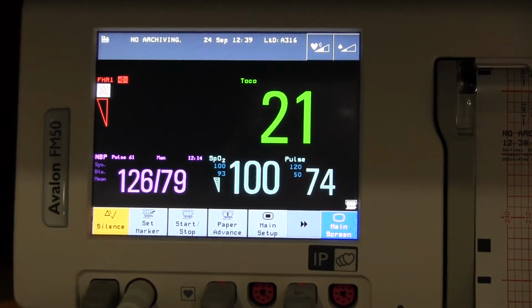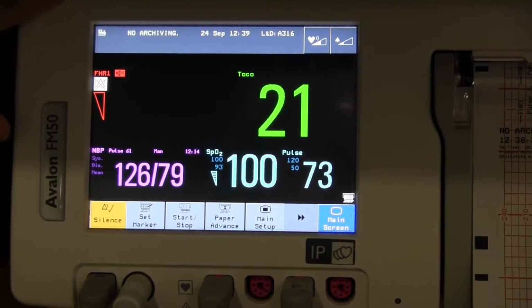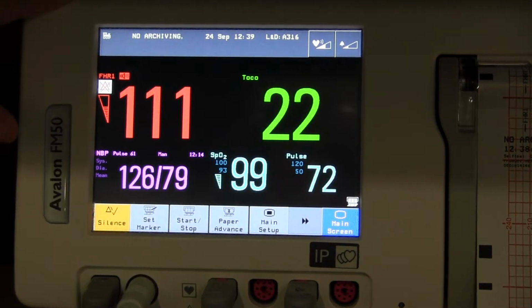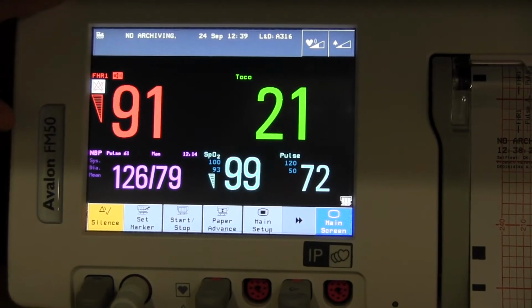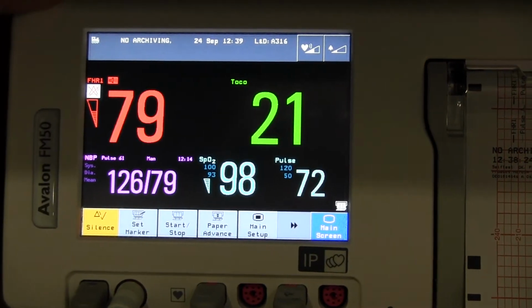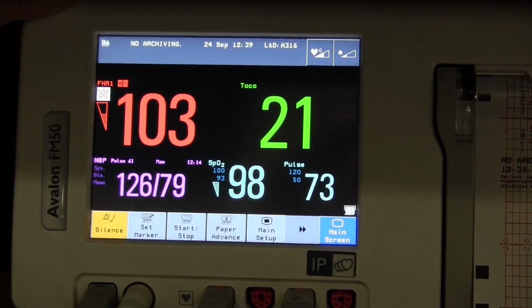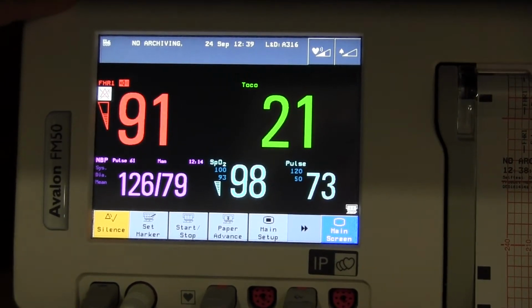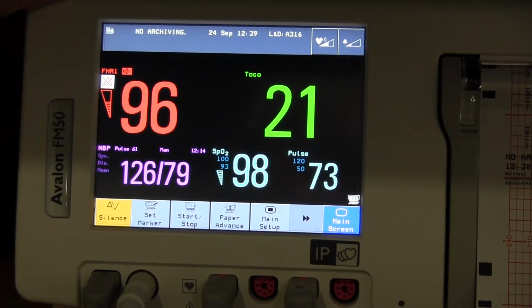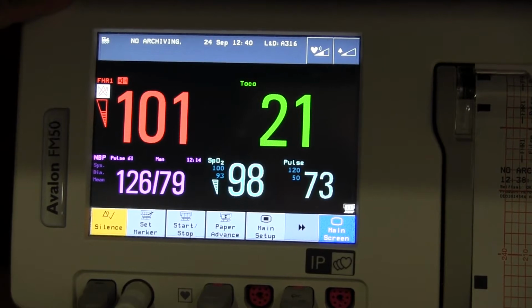Now, locate the fetal heart rate sound. Verification of the fetal heart rate is important. You will need to verify that you have the fetal heart rate and not the maternal heart rate. This is very important. You can monitor the maternal rate by using the pulse ox, the TOCO MP transducer, or by performing a manual pulse rate check. You will want to hear the fetal heart rate when first putting on the ultrasound.